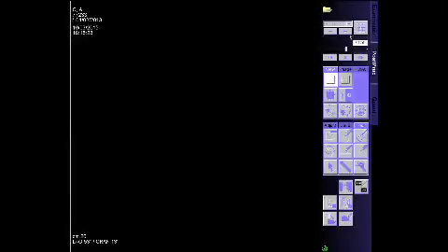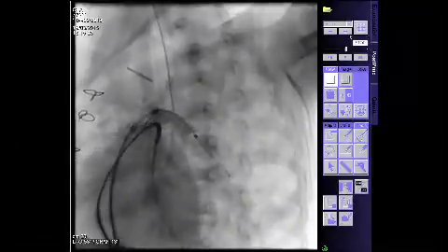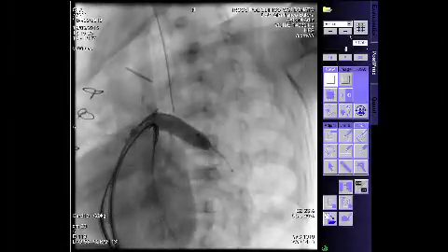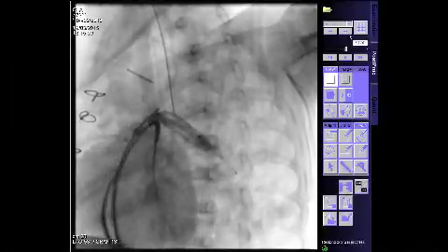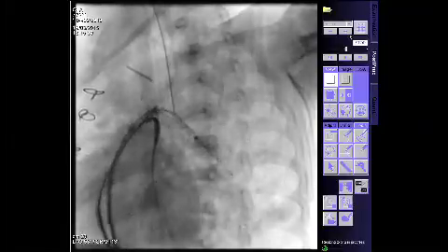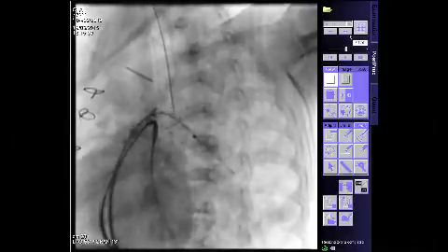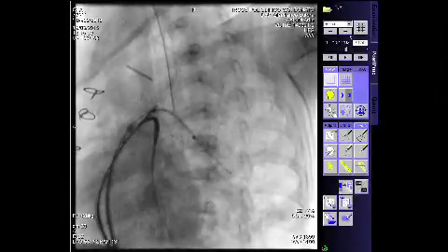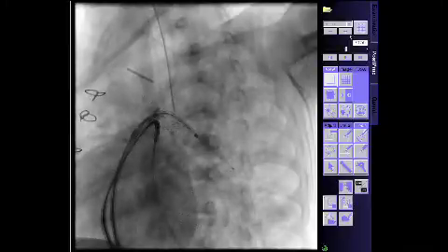Okay, go ahead. Stop. Okay, let's see. Deflate. So we may have another angio here. Very noisy deflation. We may do another angio here. Okay, it looks better to me.